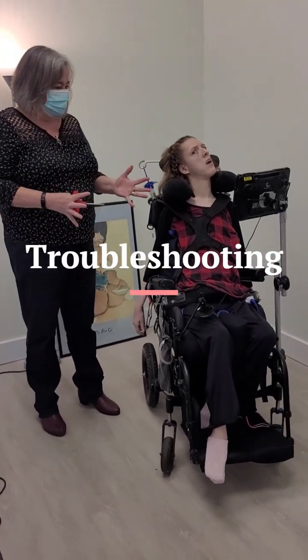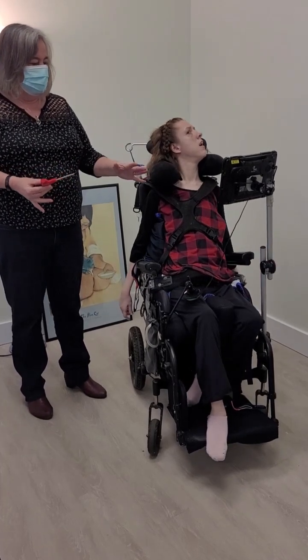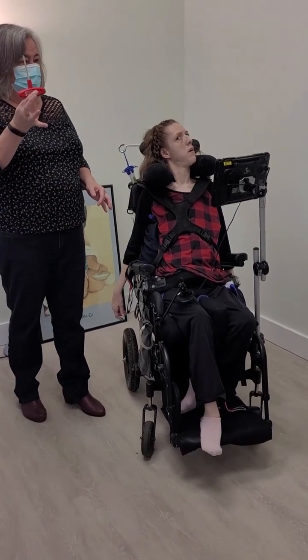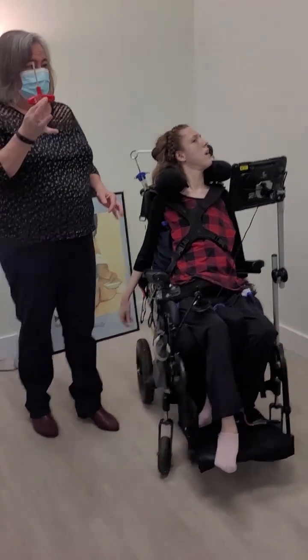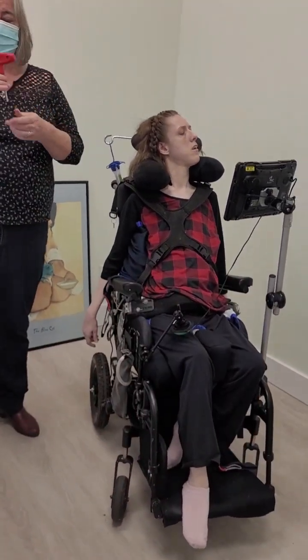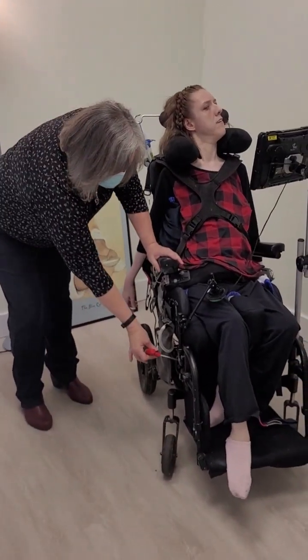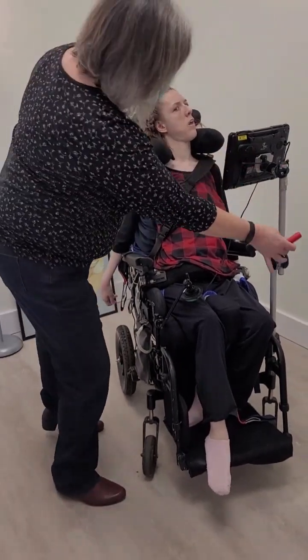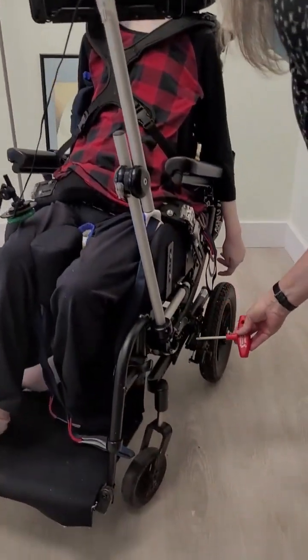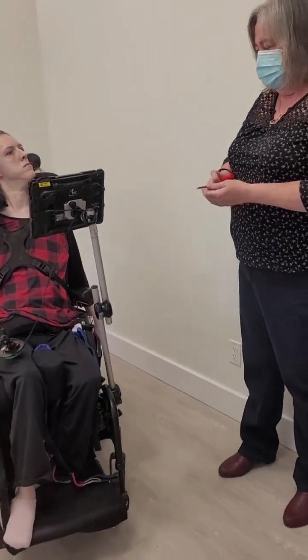Alexi has done a really good job of setting this up, so I'm going to go over some things that might not go well. If there's a lot of play in that mount, the tool for the chair is in the back of her bag or in one of the drawers — usually in the back of the bag. The red one that says Julie but also says Kaya is the tool designed for tightening this area, this area, and the very base down here. It's righty-tighty, lefty-loosey. If you're not completely tight, that's when you get the play.